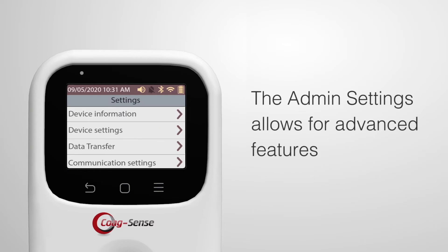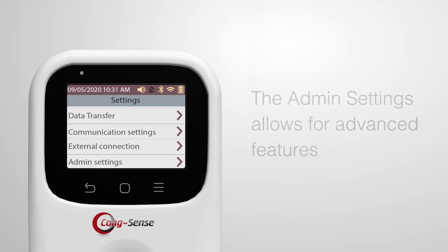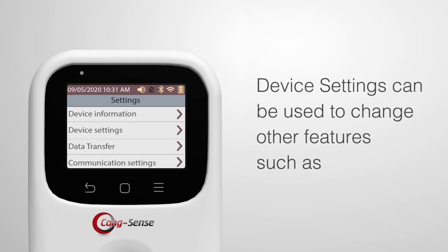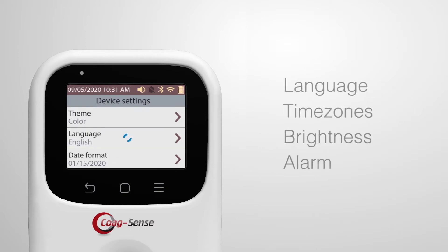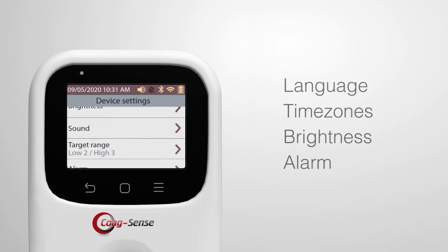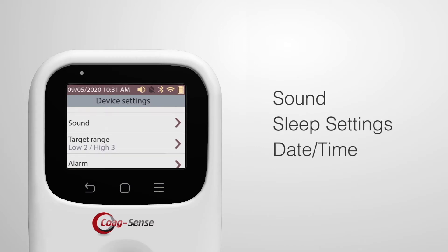The admin settings allow for advanced features such as user management, QC lockout, as well as enabling stat testing or login, and keeping the patient ID feature on or off. Device settings can be used to change other features such as language, time zones, brightness, alarm, sound, sleep settings, and date and time.